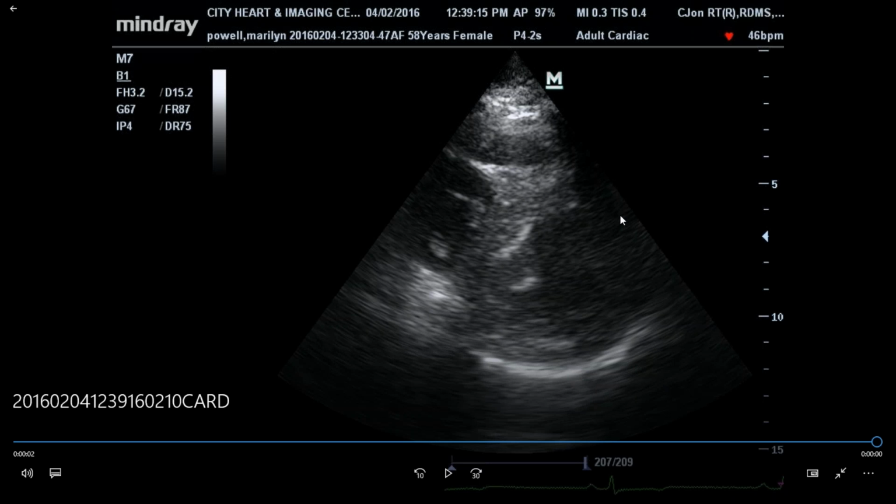So this is the myocardium. Remember, up top, this is the anterior wall. This is your inferior wall. Lateral wall is over here. This is the septum. But remember, we divide, you get 6 segments from this view.